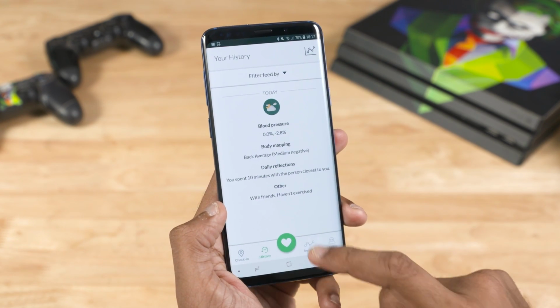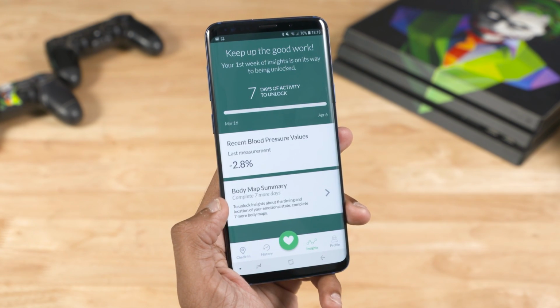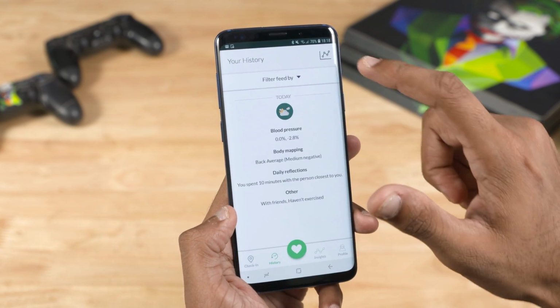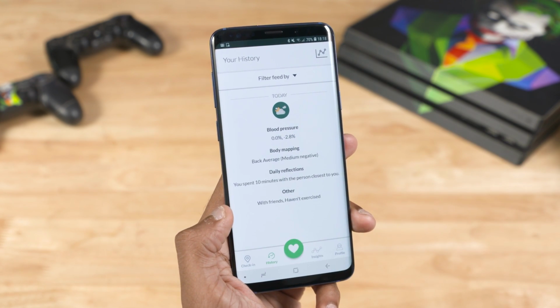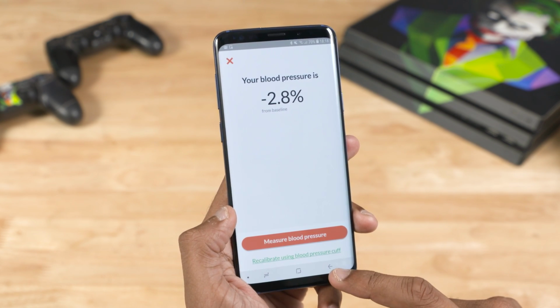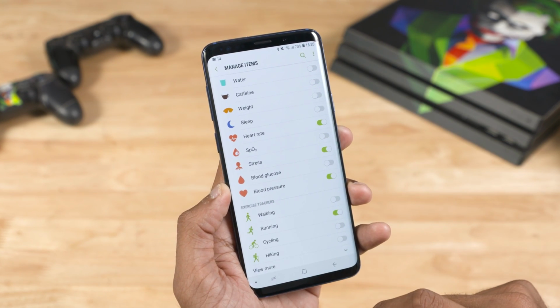There are a lot of features in this app and it seems like detailed insights are unlocked after a week of body map summaries are done. A couple of interesting things to note. You can answer a bunch of questions and enhance your experience, or I guess just improve the accuracy of the results, and the blood pressure is being given off as a percentage difference from your baseline and not in terms of 120, 80 or any number. I guess that's one of the reasons why this isn't exactly usable as medical aid. Maybe in the future, once the research has been concluded, Samsung will look to make it part of S Health.